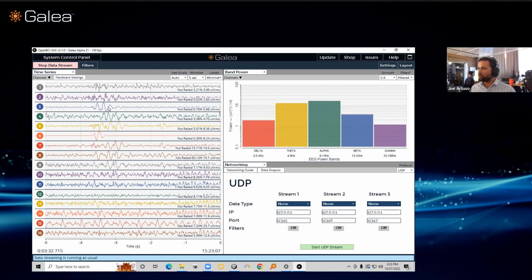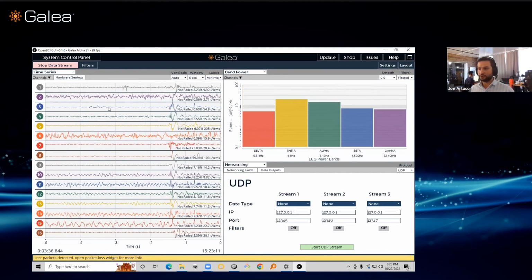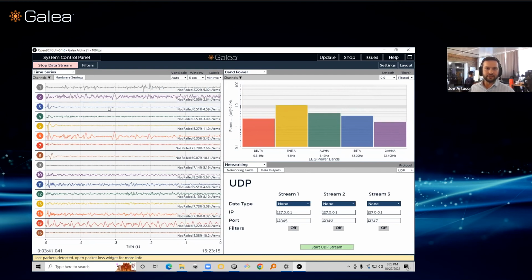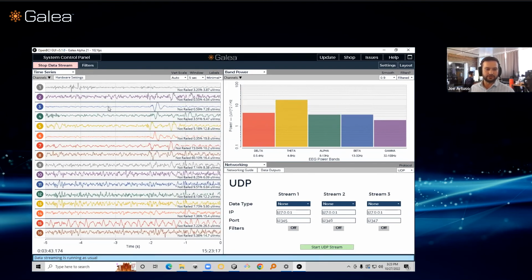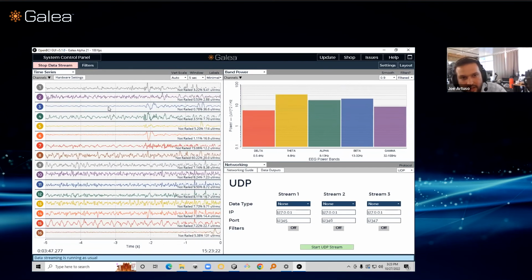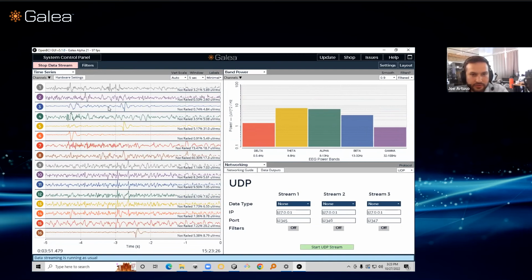What does the open part of OpenBCI represent? That stands for open source. A lot of the features of Galea will be, there's going to be an open core to Galea that will be released for people to tinker with, and then some of the features will be part of the premium software package that comes along with it.